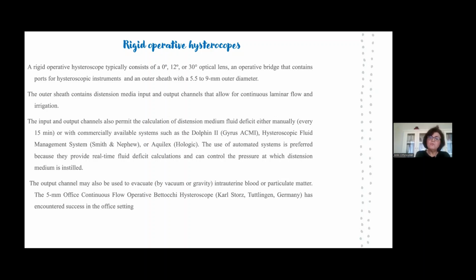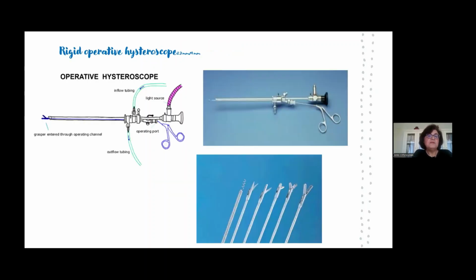The use of automated systems is preferred because they provide real-time fluid deficit calculations and can control the pressure at which the distension medium is infused. The output channel may also be used to evacuate intrauterine blood or particulate matter. This is a picture of a rigid hysteroscope.